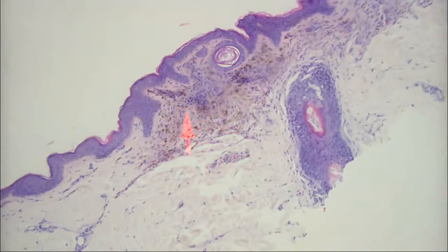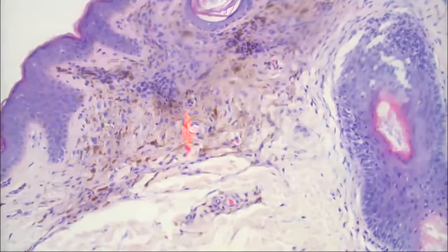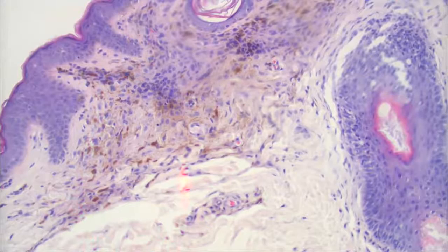A nevus, good, excellent. If it's melanocytic and it's benign, it's a nevus. So the next step is just like food: you have to be a little bit more of a gourmet. We know it's melanocytic, so what kind of nevus is it? Considering I saw the action in the dermis, a dermal nevus. Okay, we're into the steakhouse restaurant now, so we need to decide a little more. Are we going to talk about a ribeye or a fillet? So it is an intradermal nevus of some sort. Is there anything more specific you can say?